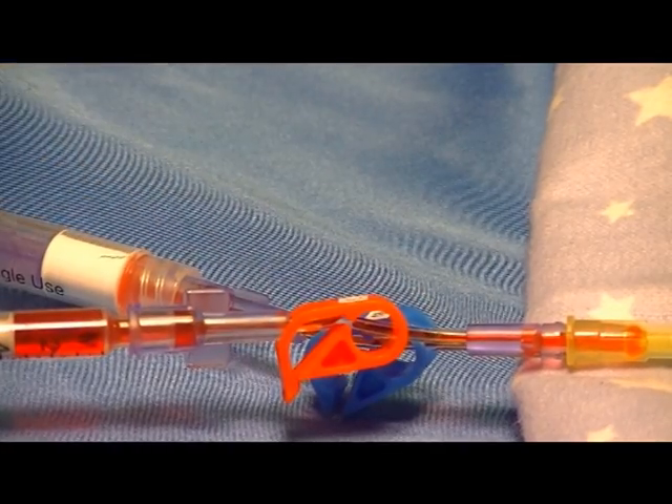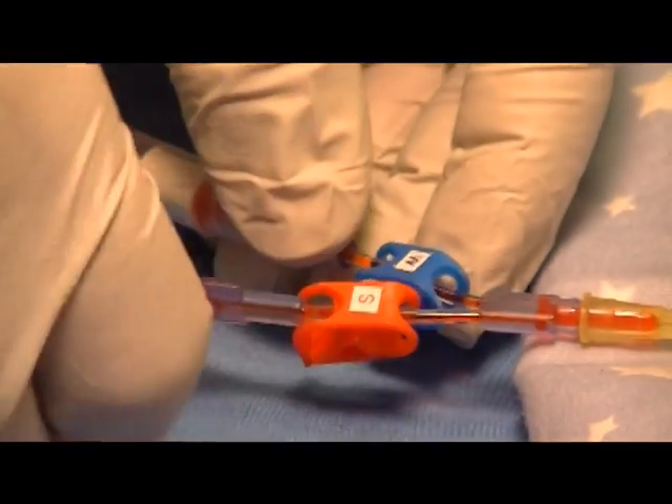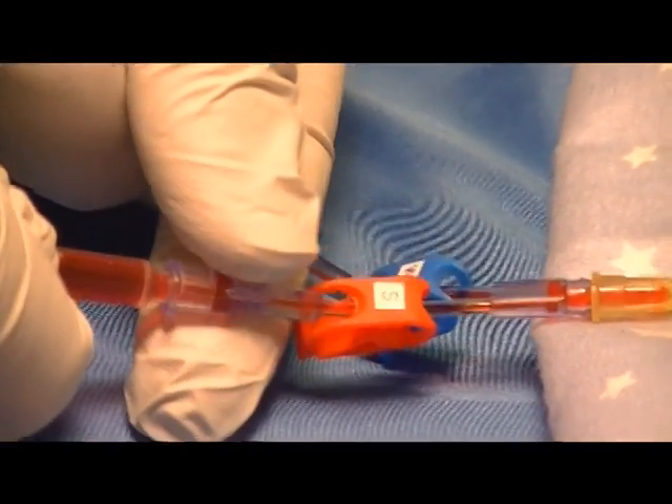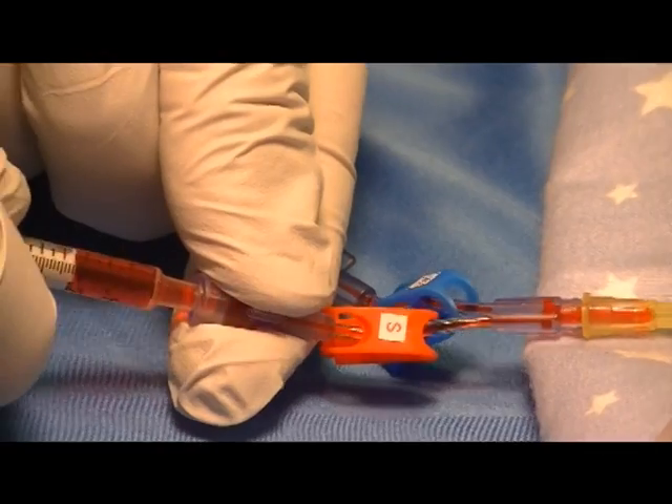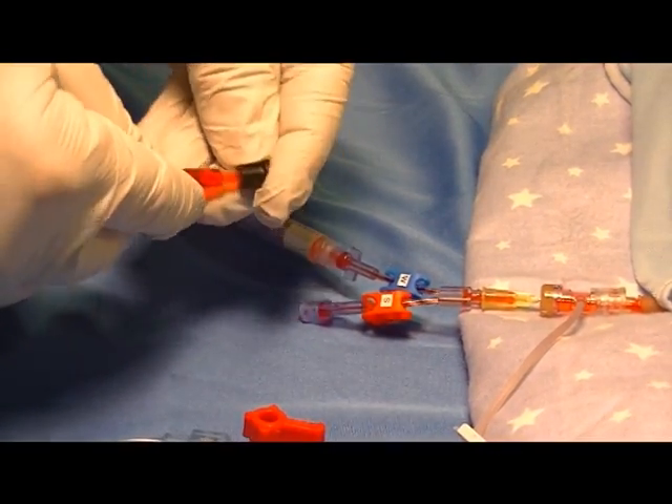Once the waste is given back, reclamp the blue clamp, go to the sample side, remove the sample, cap it, and send it for testing.